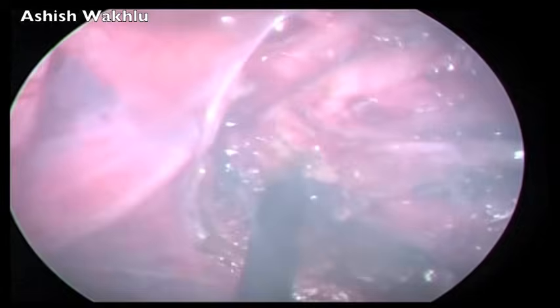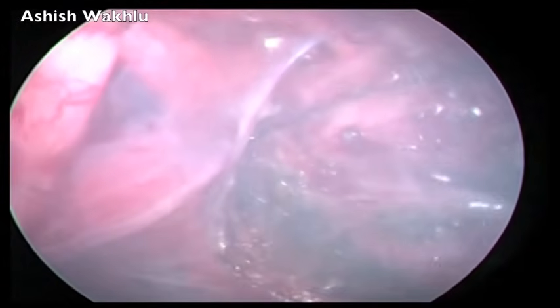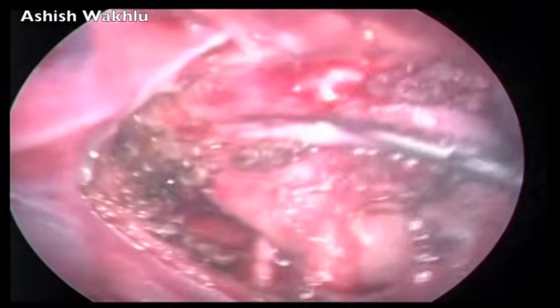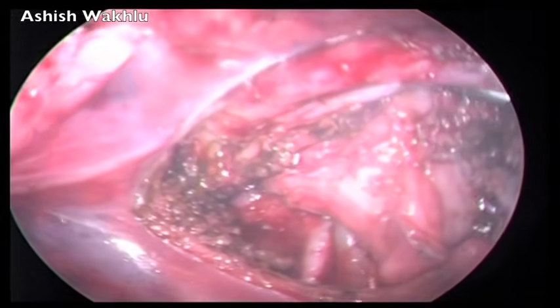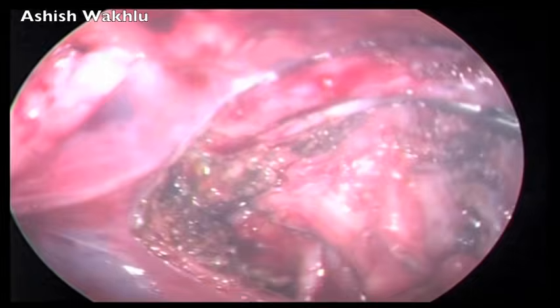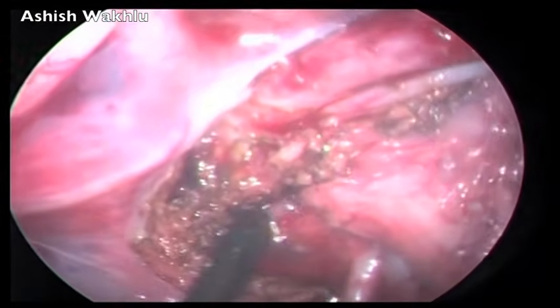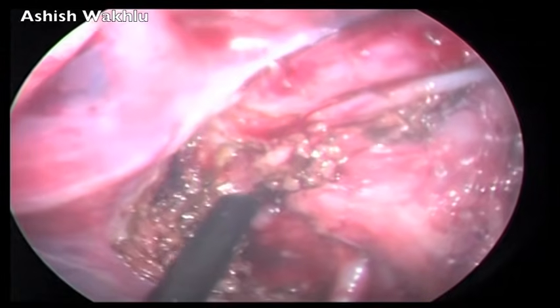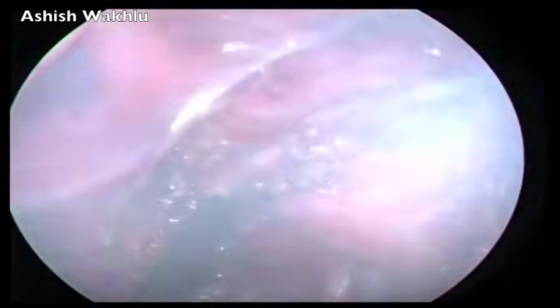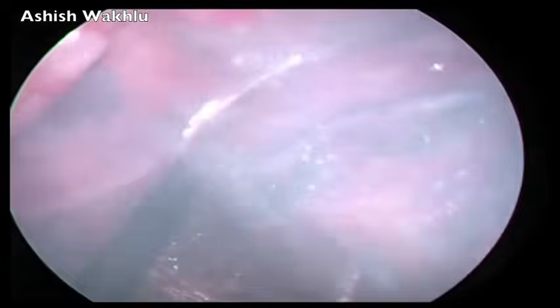For obvious reasons, it is safer to divide the fistula from behind forwards, as you open the lumen at one point and get a guide to the wall of the rectum, and then you can divide the walls individually anteriorly until the entire width of the fistula is cut through. But this is a matter of personal preference. I suppose if the anterior limit is equally clear, division can be taken from before backwards.